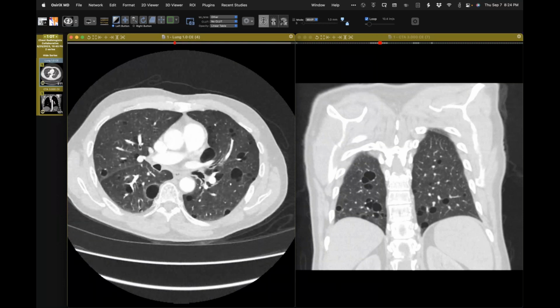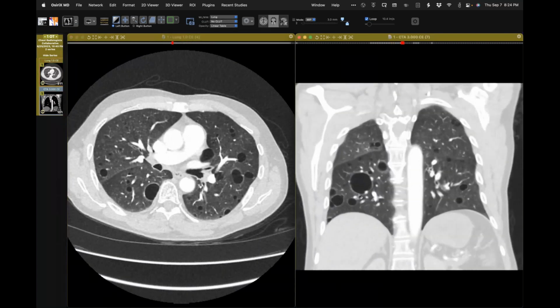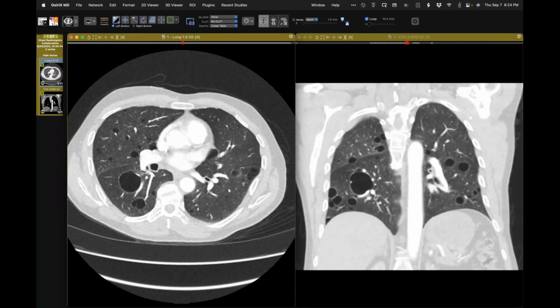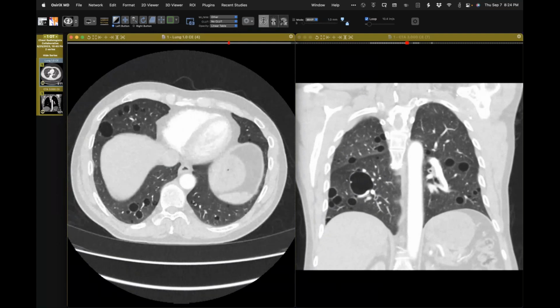I've seen Birt-Hogg-Dubé, usually they're a little more elongated and so-called floppy, and I've not seen that many cysts with Birt-Hogg-Dubé. I think it's in the differential, but they're not the most typical ones. And I absolutely agree they're not the cysts of PLCH.